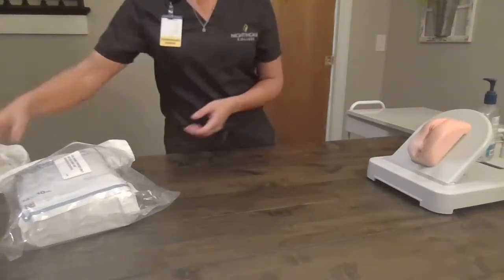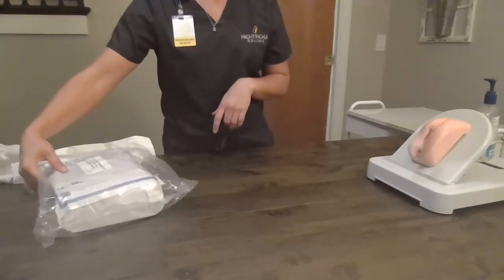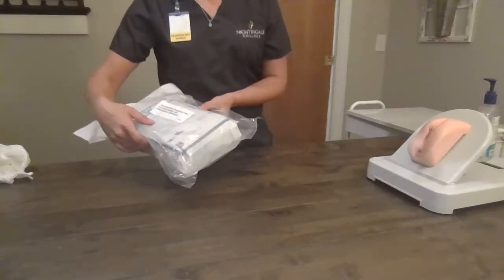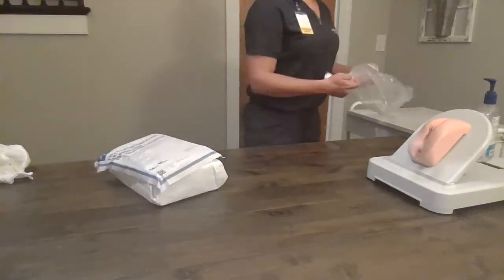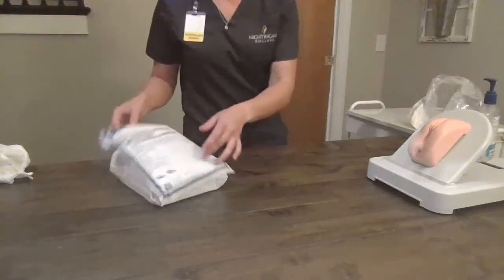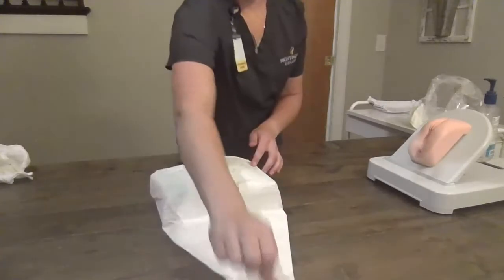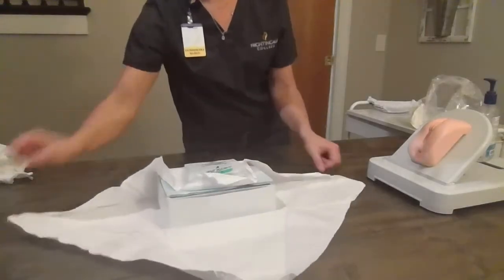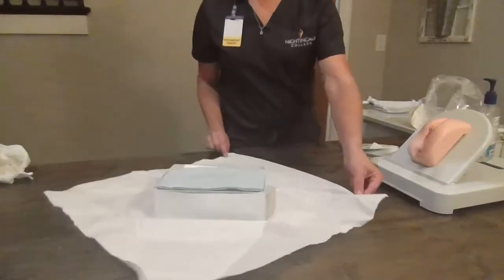Ms. Smith, this is a sterile procedure, so I'm going to put my Foley catheter between your legs. Please don't touch it during the procedure. I'm going to verify this is the right Foley for her — it's a 14 French with a 10 ml balloon. We're going to maintain our sterile kit by only touching the one-inch margins. I'm going to pull out my gloves and then finish opening up my kit.